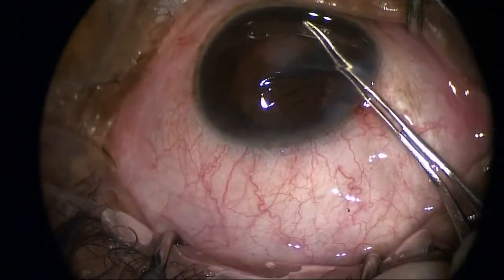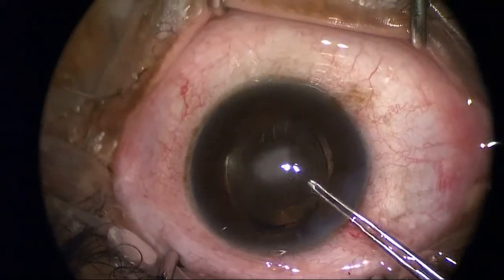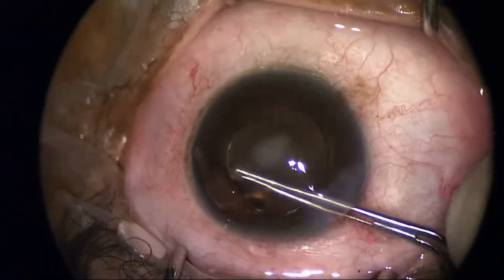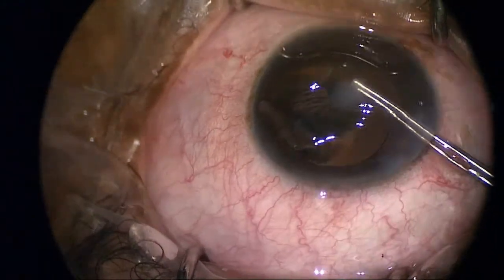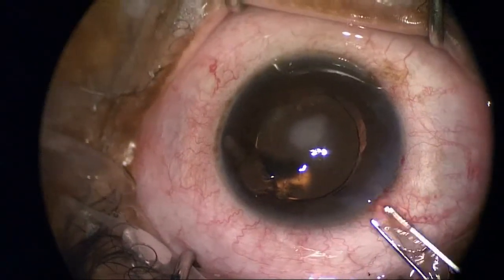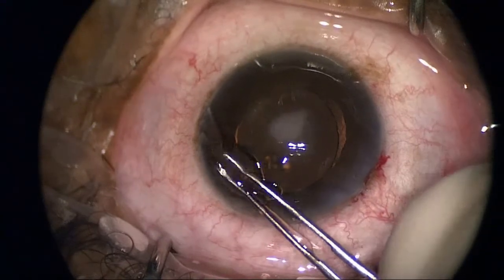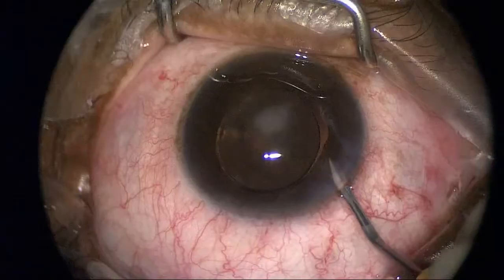I'm going to tear this around in preparation for the donor tissue. I have a specimen here that I pass off to the pathology lab and also for Dr. Natalie Afshari's research that looks at the genetics of Fuchs corneal dystrophy. I'll go ahead and just tear this off and submit it — that goes on some filter paper.